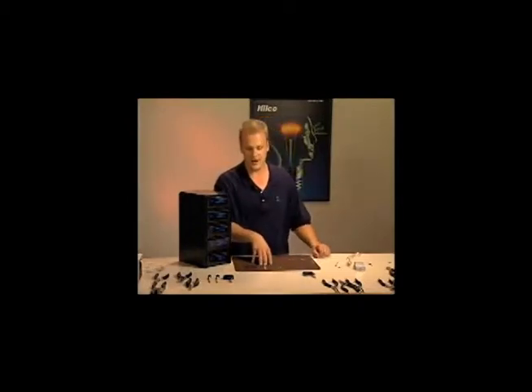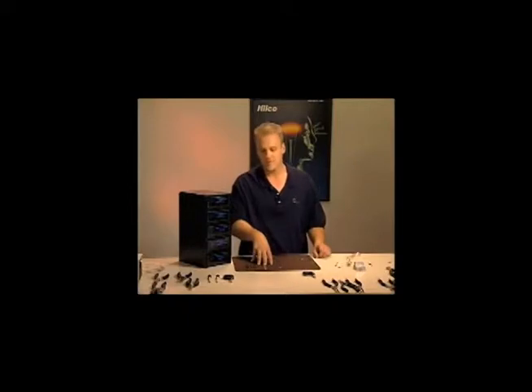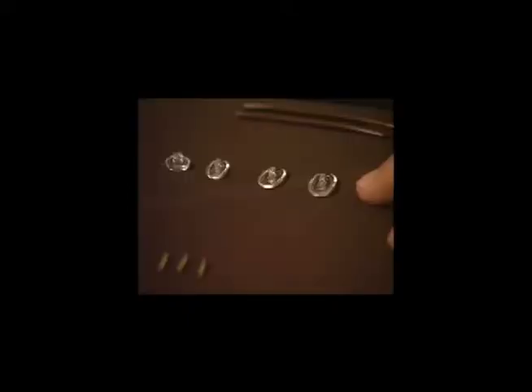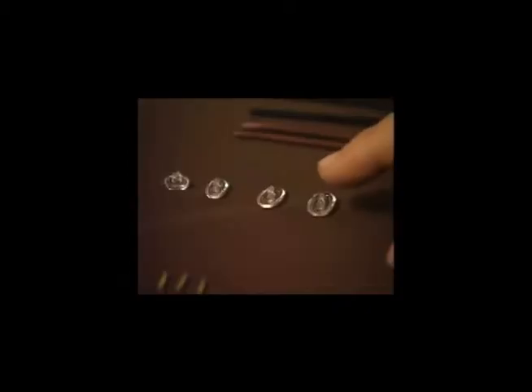For nose pads, many practices inventory all different styles and kinds of nose pads, different materials. There's plastic and vinyl and silicone. There's screw type. There's push-on type nose pads. There's a system devised called Logic nose pads, where it has a patented assembly, and the pads fit both the screw type and the push-on type, so there's no need to inventory both anymore. They're made out of a premium silicone material. They have a unique oval design in which 4 pads actually replace 20. There's a 17 millimeter oval, a 15 millimeter, a 13 millimeter, and then a 9 millimeter round button, which is the most popular round button pad out there.